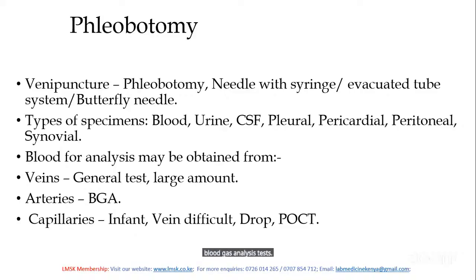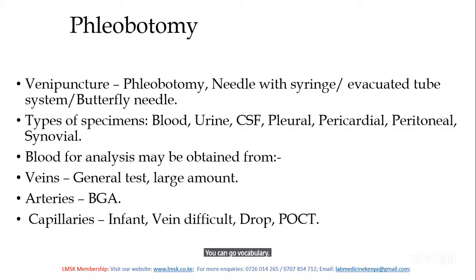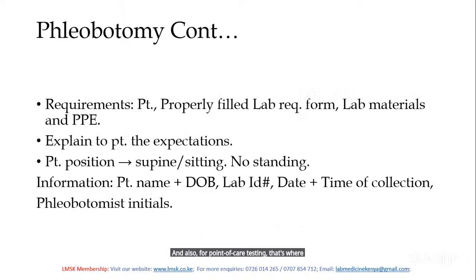And the capillary, it's when you don't need a lot of blood. When you need a drop, go for capillary. When there is a difficulty in getting blood from the vein, you can go for capillary. For infants and also for point of care testing, that's where capillary is recommended.